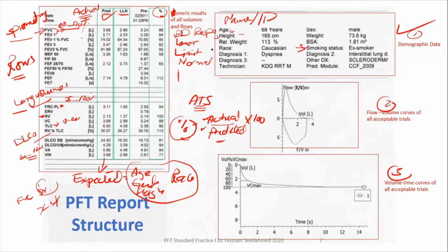We even talked about there being a lot of methods to measure the height, so there is no way you should skip this. Even if your patient is lying in a vegetative state in an ICU bed, you can measure his height. So height is important. Now all of these numbers depend on the age, the height, the gender, and the race. These are the 3 important things.